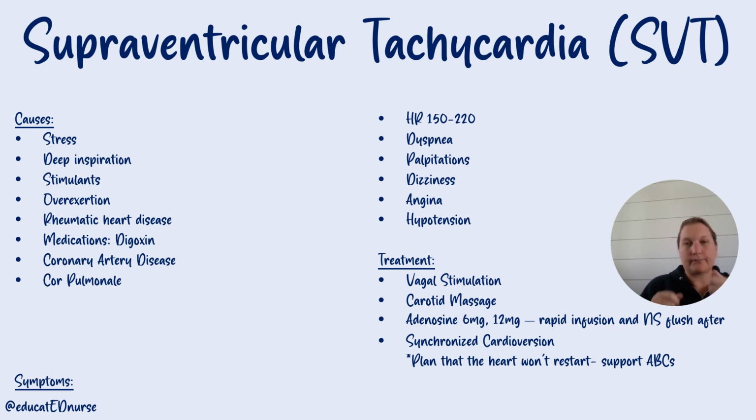So what we have at work is this thing called a stopcock. It's like a 3-way stopcock. You put one end on the end of the IV tubing. You've got another end that goes off to the medication, and then another end that goes to a saline flush. And it's got a little valve on the top, and you just turn it to the medication. You turn it open, you slam the medication, and then you slam the saline behind it. Again, it's got a 6-second half-life, so you got to get that in.